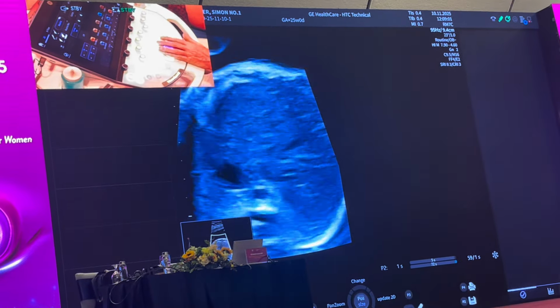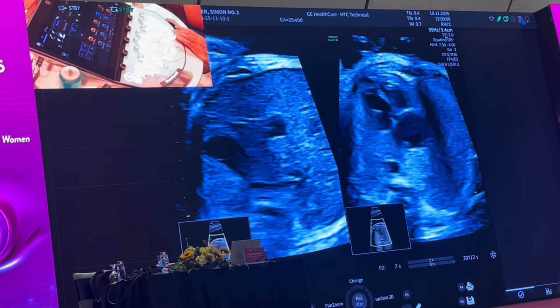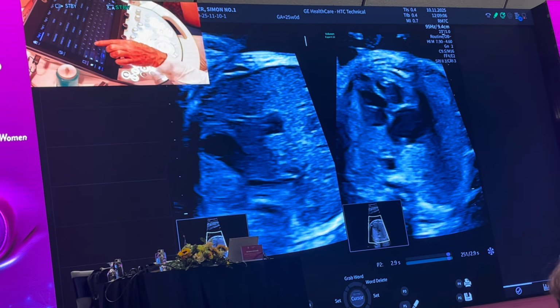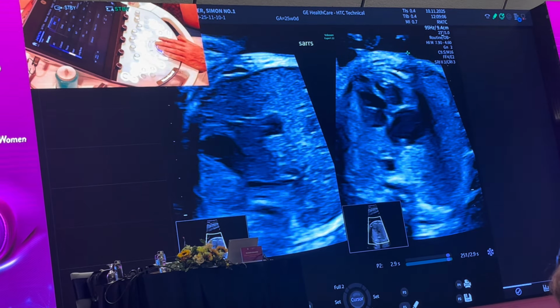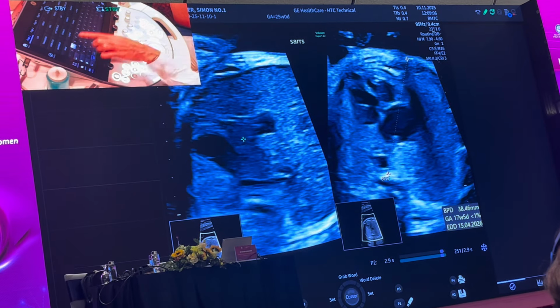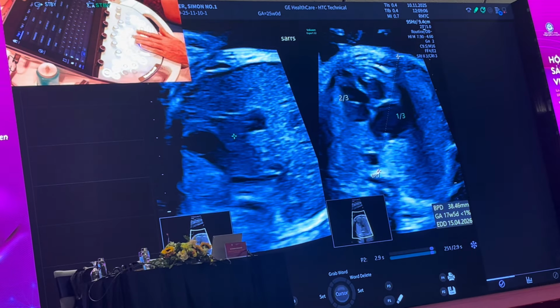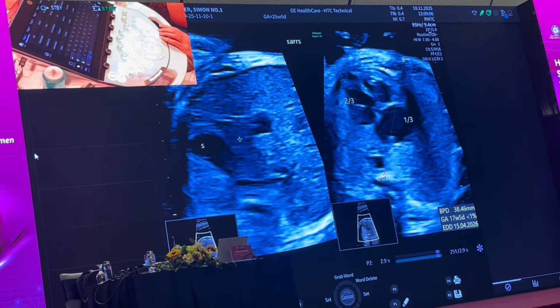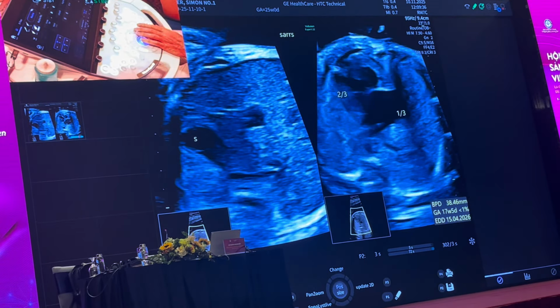And then in doing the evaluation, I confirm that the stomach is on the left-hand side, and I confirm that the heart is on the same side as the stomach. So I start off by doing everything: examination size, axis, rate, rhythm, and cycles. When I look at the heart, I look at whether 2/3 of the heart is in the left hemithorax, and 1/3 of the heart is in the right hemithorax. This is important in terms of excluding cardiomegaly. It's important to show that the stomach is on the same side, because babies with atrioventricular septal defects will frequently have the heart and the stomach on different sides.